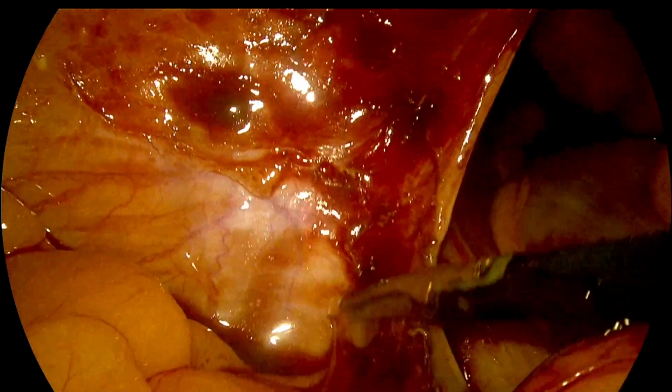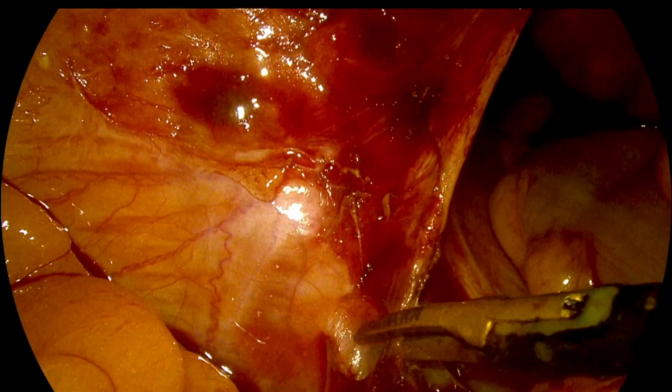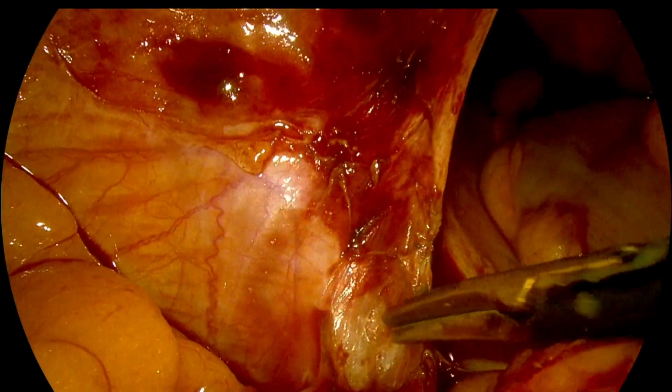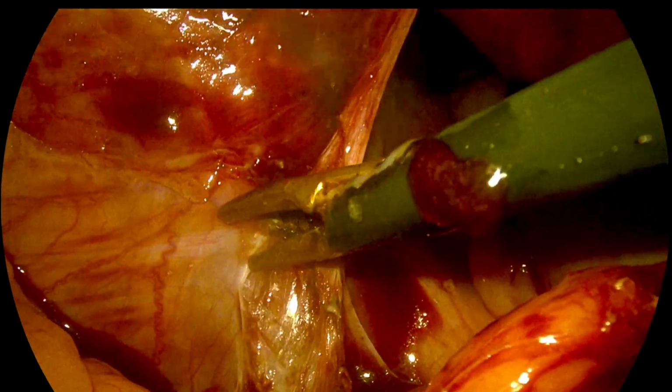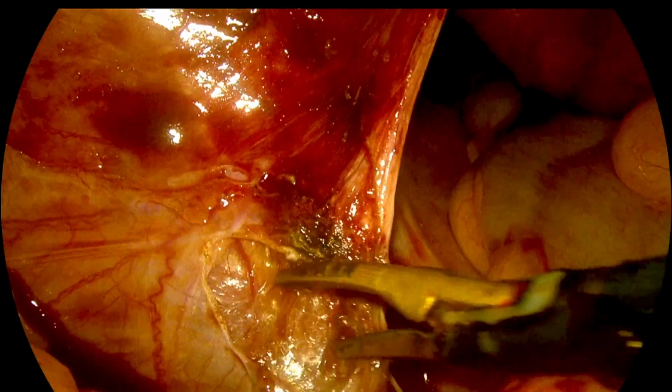So we are trying to enter the retroperitoneal area and identify the ureter, and then further dissection becomes easier. Identifying the ureter is the only way to prevent injury to the ureter, especially in a patient like this, whenever there are adhesions from previous surgery.